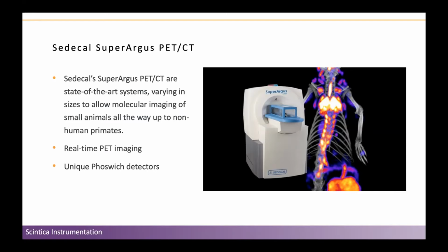So you can use this as a standalone PET system or a standalone CT system, or you can combine them and it's all integrated together. So it's really nice to have this system fully integrated. It allows for easier comparison between the two modalities.